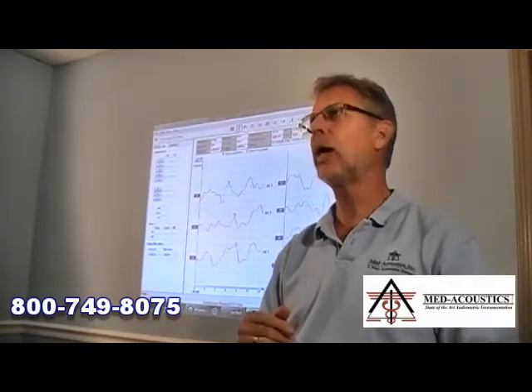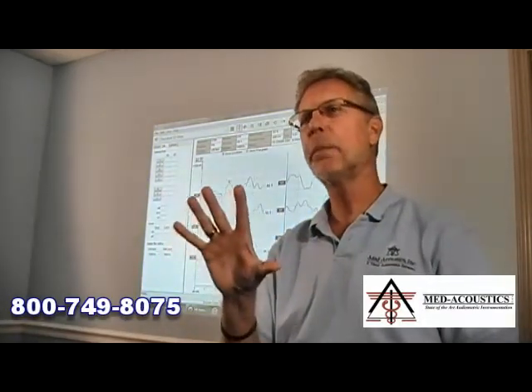Okay? That's one thing. Another thing is there's a feature in the Eclipse which no other clinical ABR or auditory evoked potential system has. The only one that comes close to this, and in fact has something very, very similar, is the Vivosonic, the unit that's made specifically for non-sedated pediatric ABR applications. This system has what's called Bayesian weighting. Bayesian weighting is a method of filtering the responses from the patient coming in, sample by sample. And the way they do it is to look at each sample and analyze its signal-to-noise ratio.